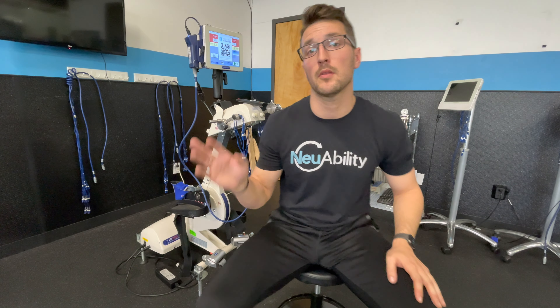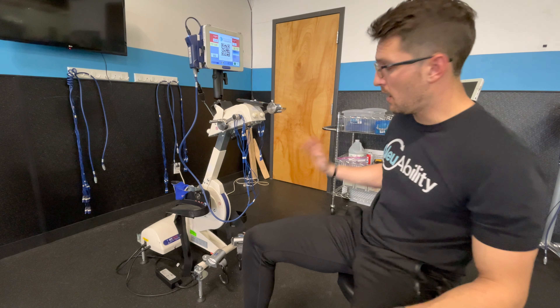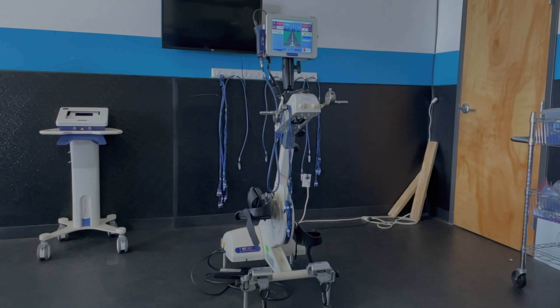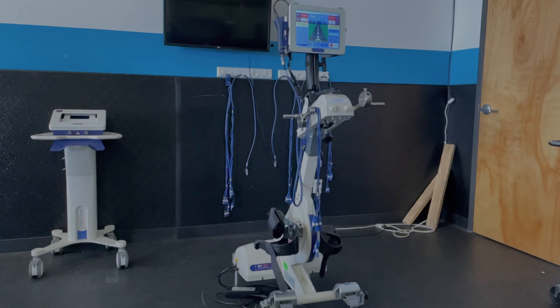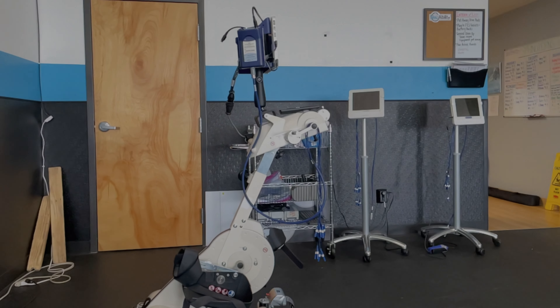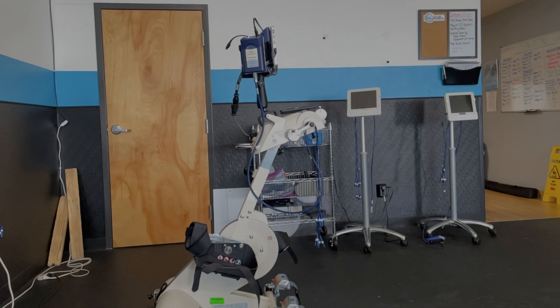Hey guys, Dane here from Adaptive Exercise and Rehab, coming back with another video covering our FES bike. Our FES bike is a state-of-the-art piece of equipment that stimulates paralyzed muscles to contract in a fashion that has been pre-programmed by the machine. This one in particular allows clients to pedal in a bicycle-type fashion.